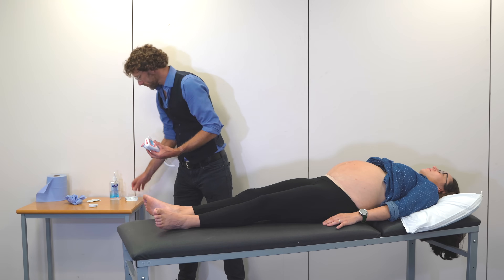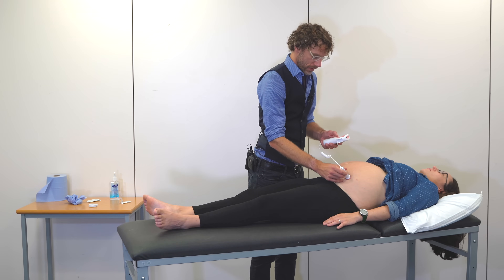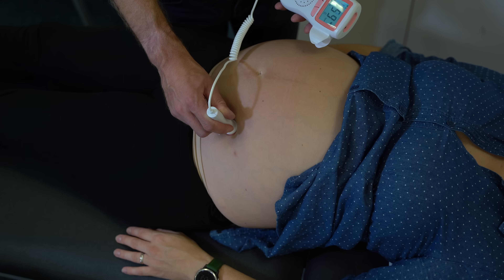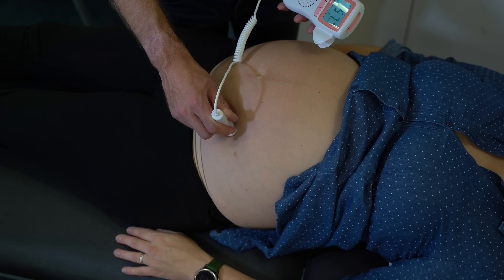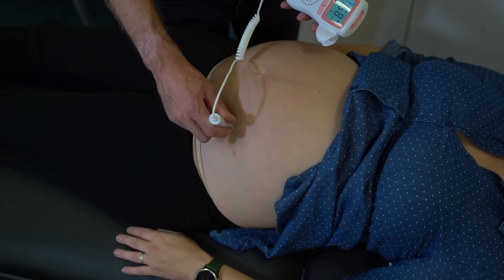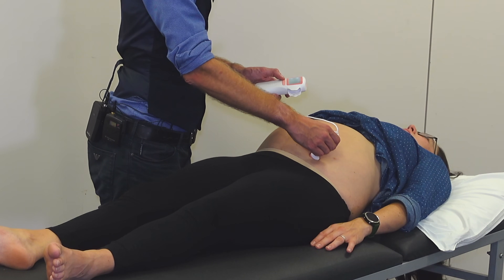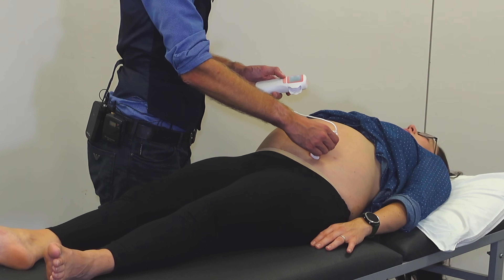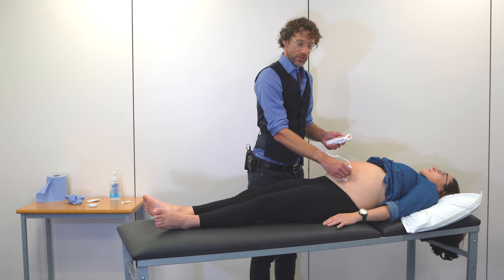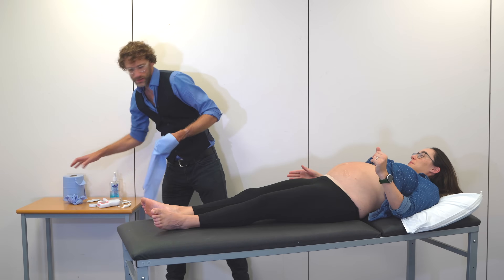We get our probe and apply the jelly. Because we've identified what we think is the shoulder on this side, we'll have a quick listen. We found it straight away — 150 beats per minute with a nice gallop rhythm. Moving the probe around to a much more whooshing sound — it's a bit slower — and now we're listening into the placenta at around 75 beats per minute, the slower maternal circulation. We take the probe off and use the NHS blue roll to wipe the gel away.